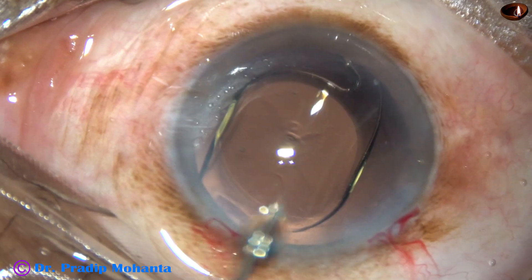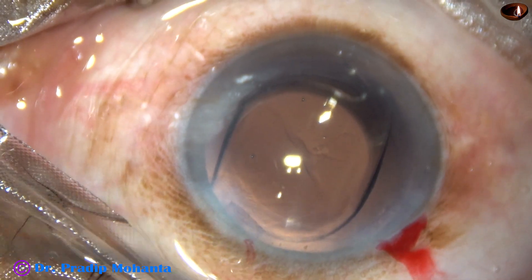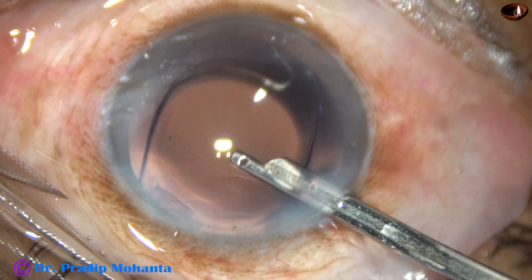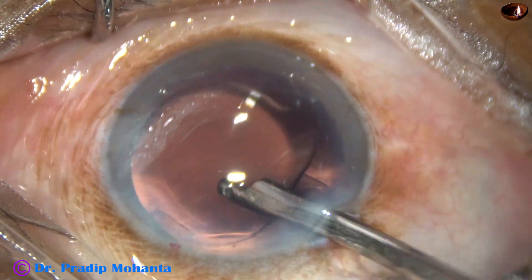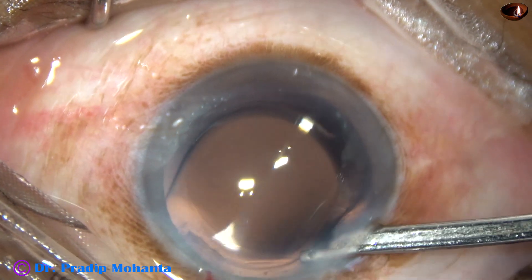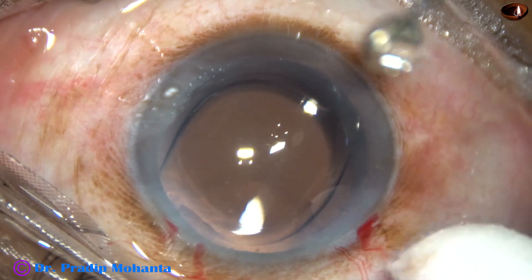The surgery is almost done. This is a bit of moxifloxacin, and now the side port is to be closed. Corneal stroma on either side of the side port is hydrated — the lips become thick and the side port closes. This is the final lavage of the anterior chamber with irrigation and aspiration. The Simcoe is used to form the anterior chamber very nicely, and then the integrity of the wounds is checked. And then the case is concluded.